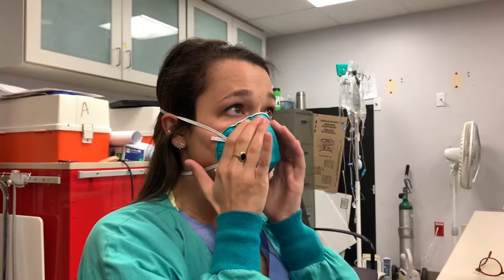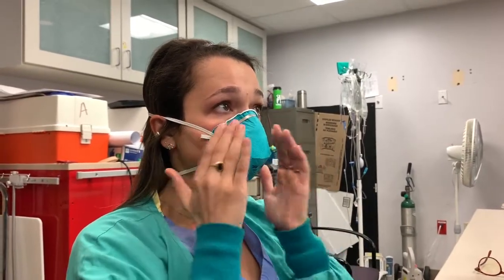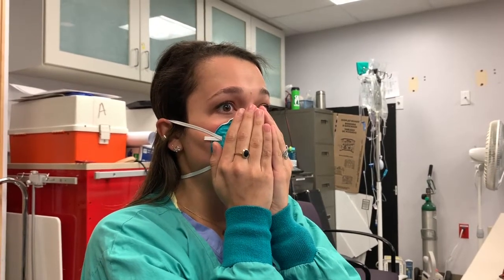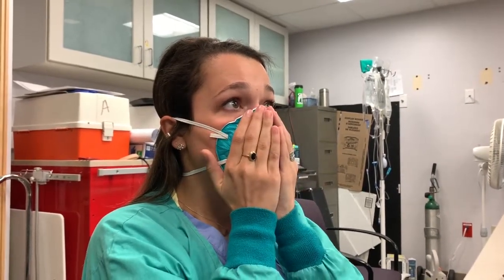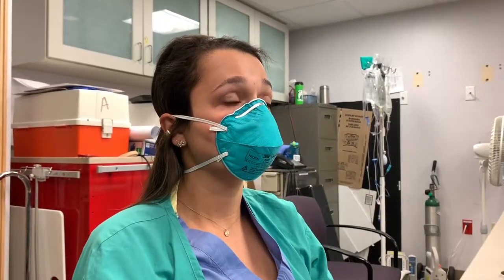Pinch the bridge of the nose to make sure it's nice and snug. Place your hands over the surface of the mask and blow air out — make sure there's no air coming out and leaking. If there is leaking, re-seat the mask: check your straps and make sure everything is snug.